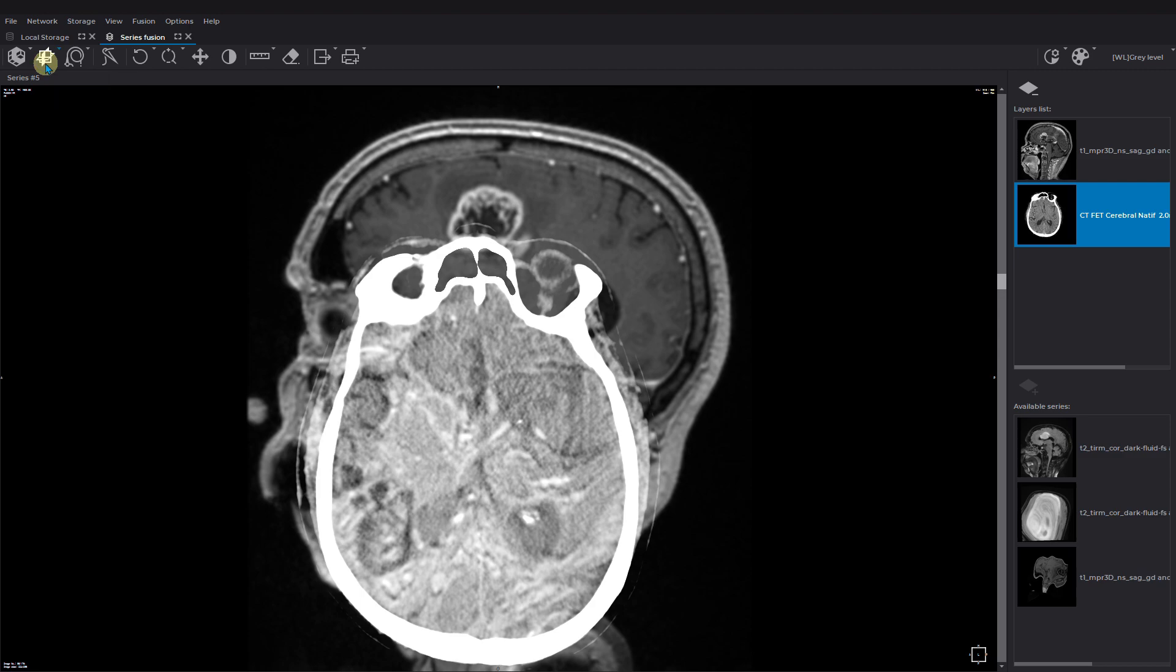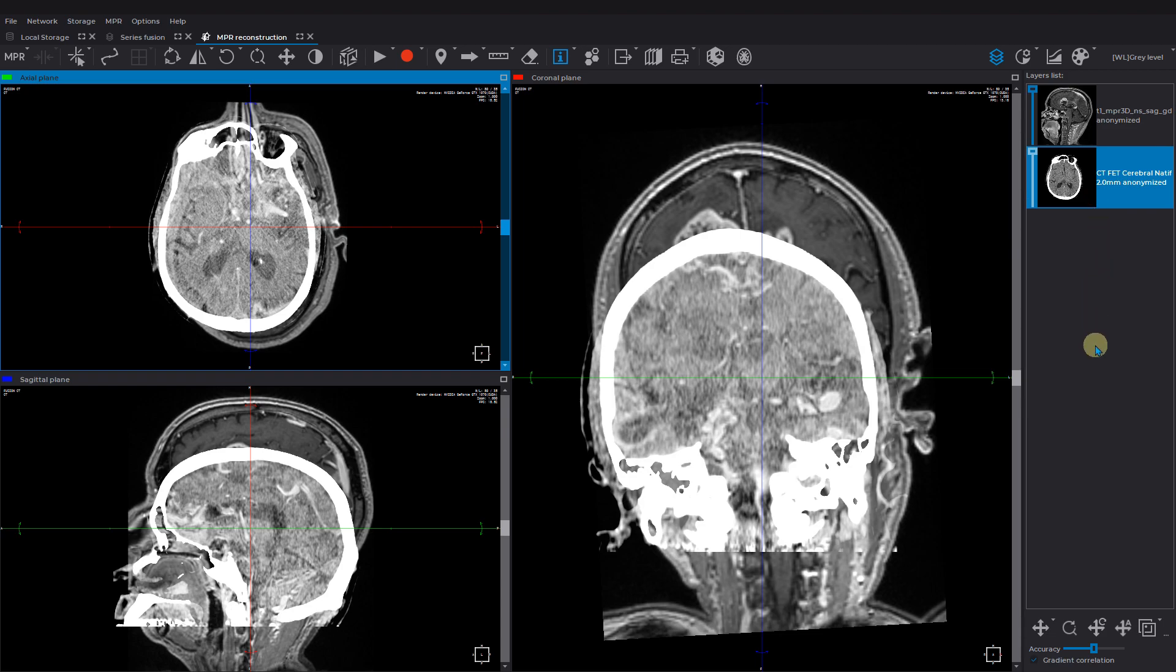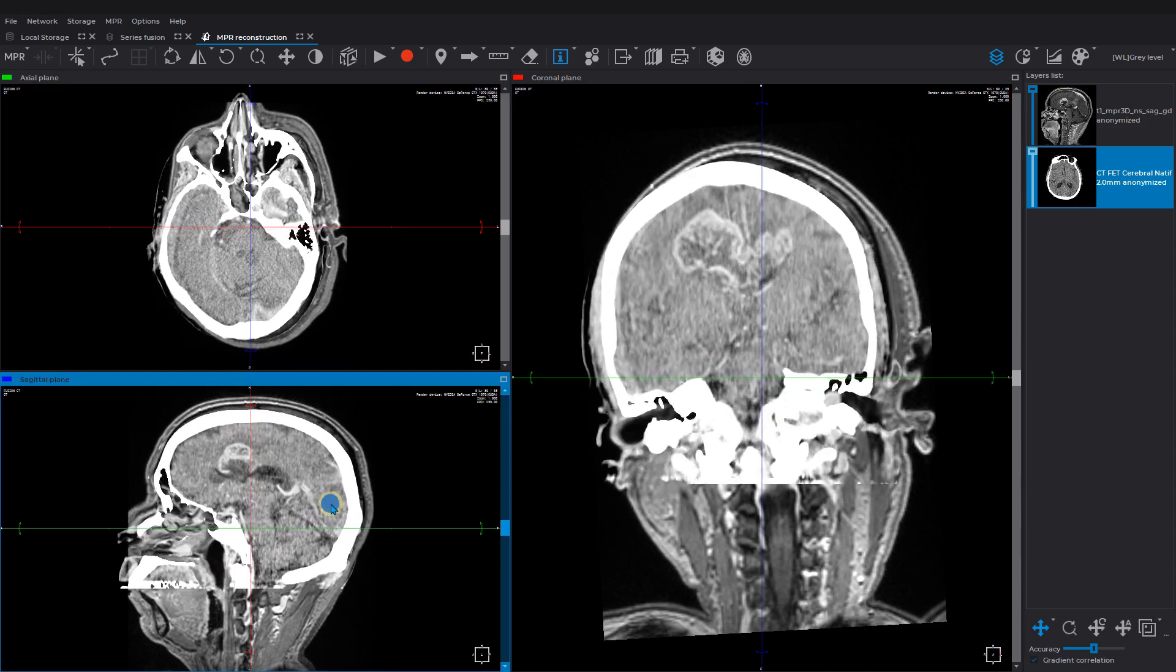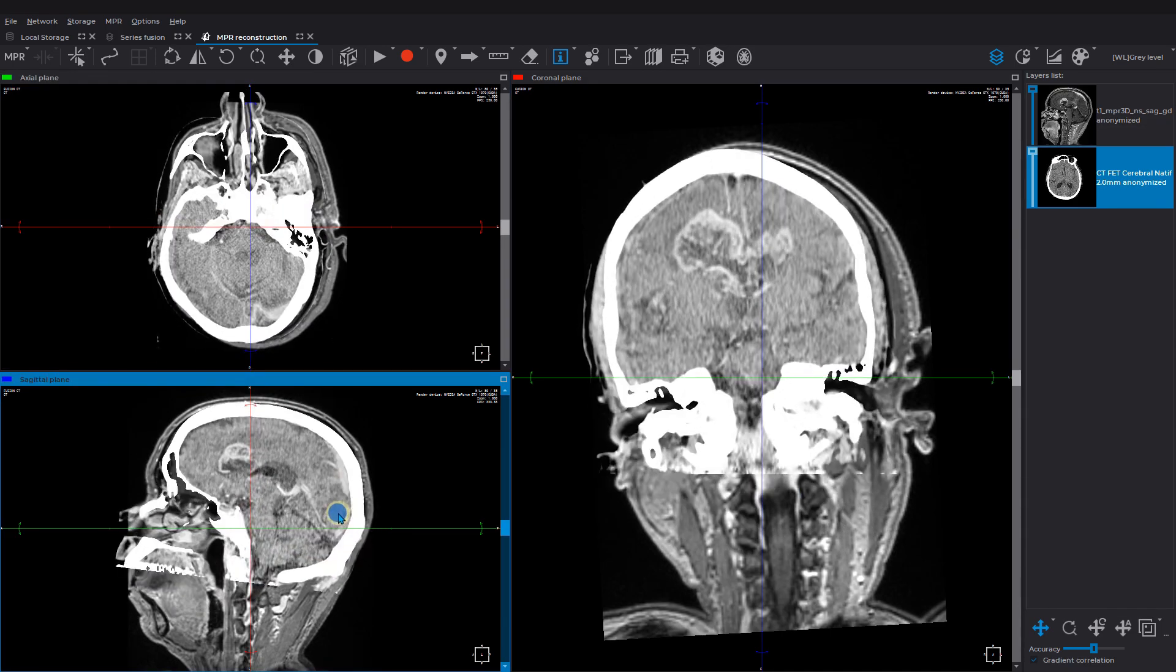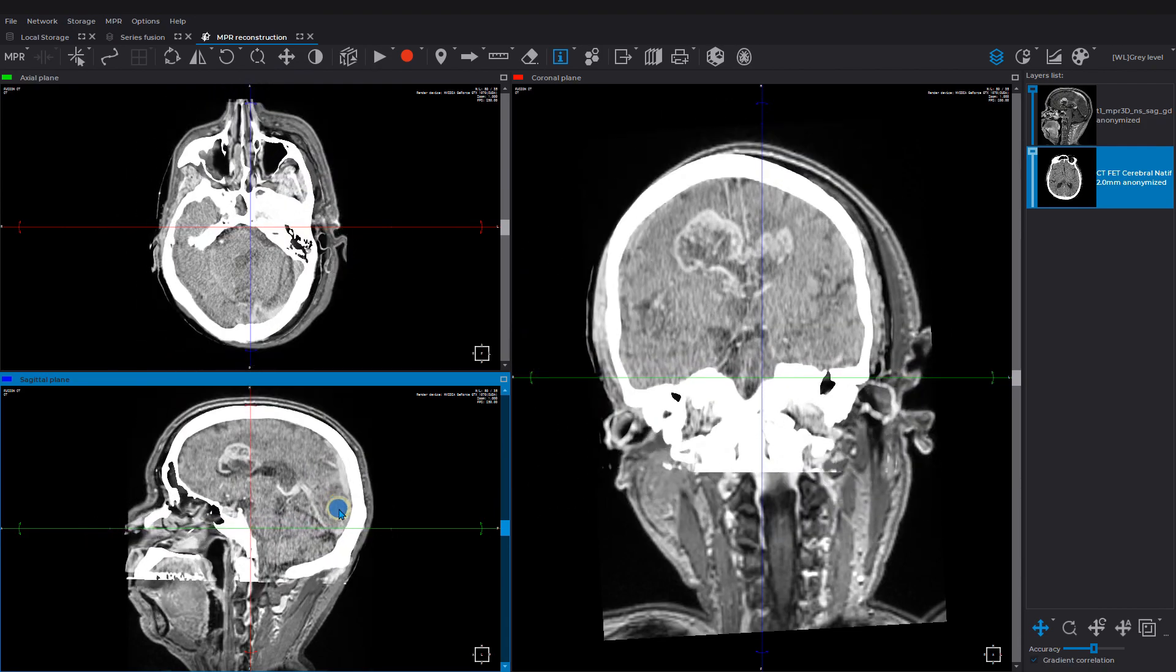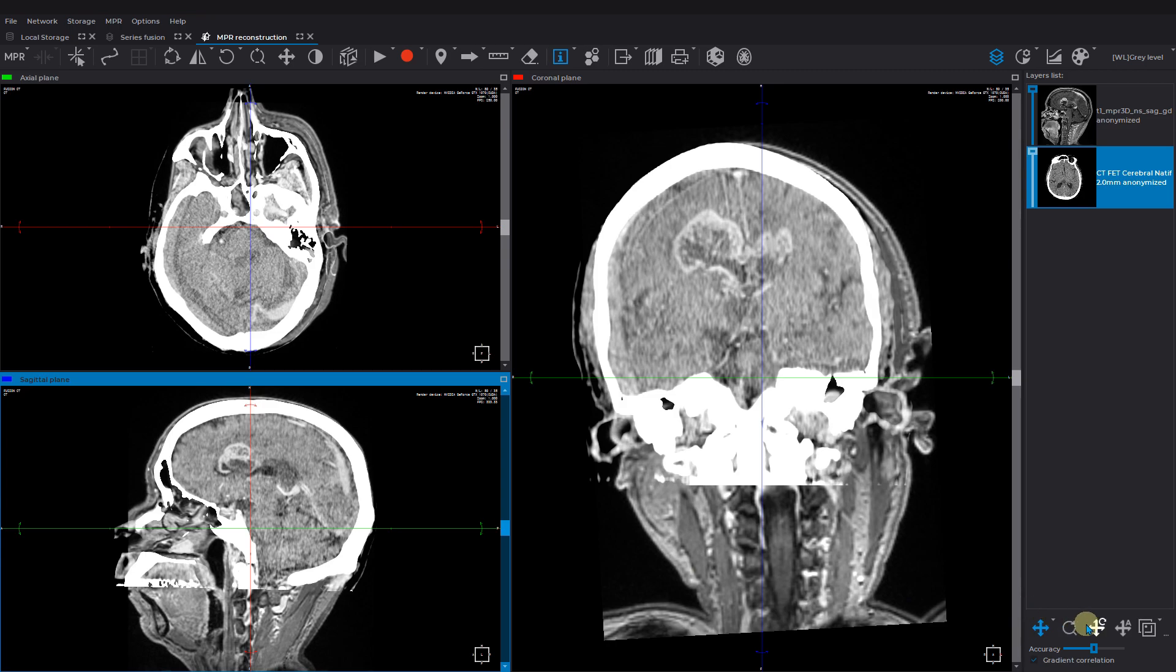If the layers are displaced with respect to each other, you can merge them manually, automatically, or by points. Manual Fusion allows you to move a layer or rotate by pressing and holding alt button. You can also resize the layer by pressing and holding control button. To reset all transformations, click on the respective tool icon.